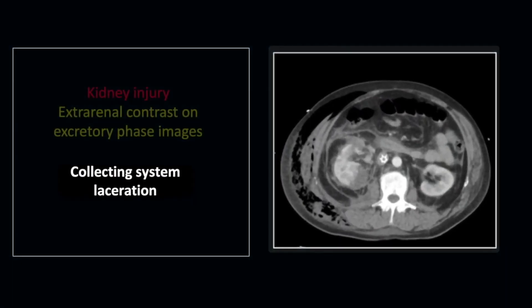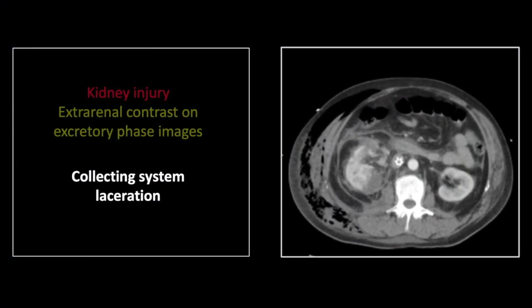Our next case is a classic collecting system laceration. Of course, you have to wait for the delayed and excretory phase images to exclude this particular injury. So on the initial corticomedullary phase, there is a devascularized, hypodense, non-enhancing segment in the medial posterior right kidney.